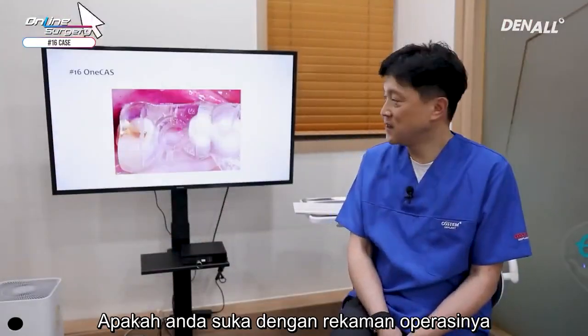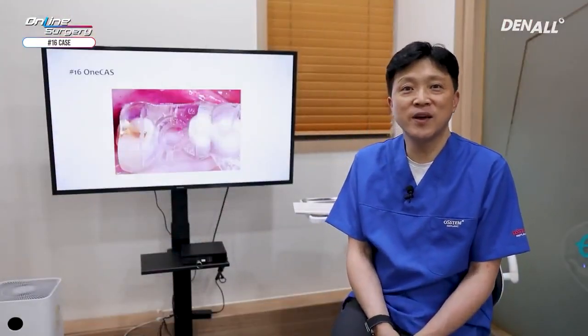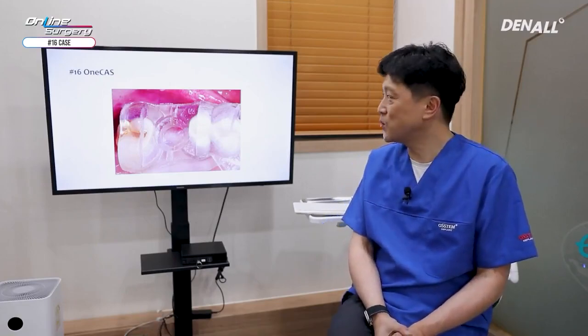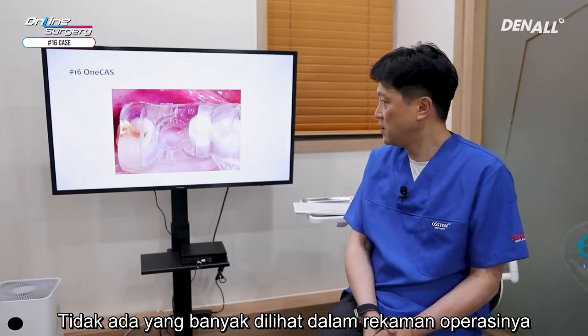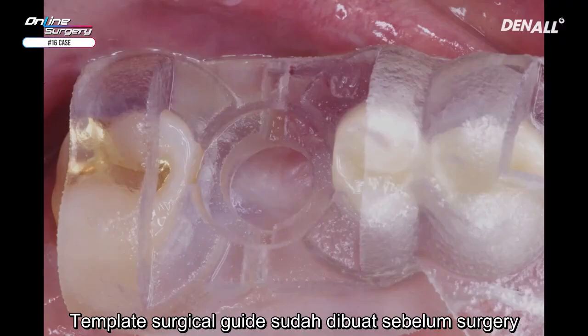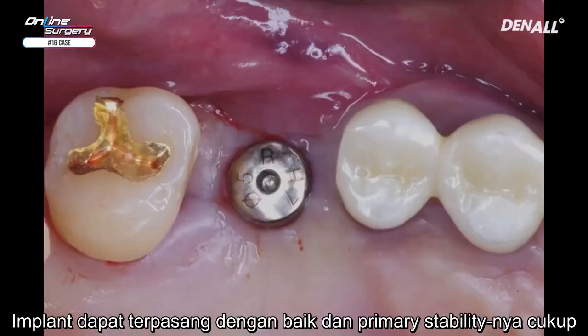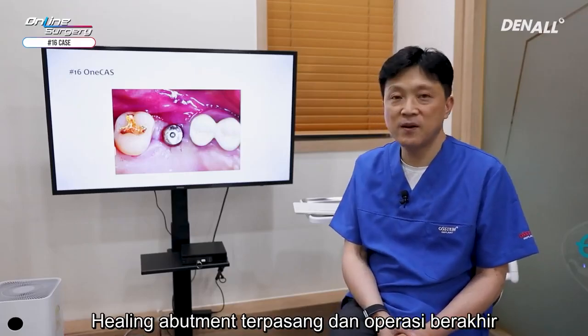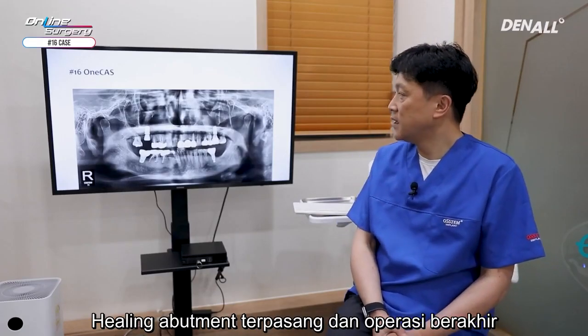Did you enjoy the surgical clip? When you use OneCAS for surgery, there's not much to see in terms of the surgical clip. The template was adapted before surgery and the implant was placed nicely. Primary stability was sufficient. The healing abutment was connected and the surgery was closed.